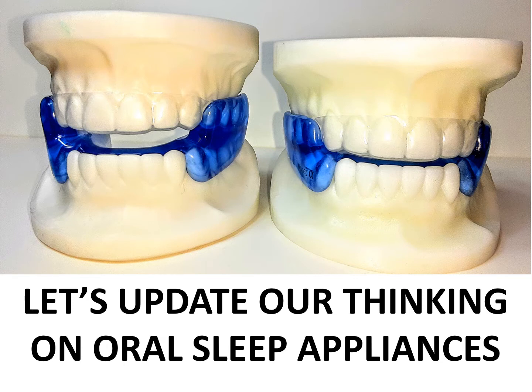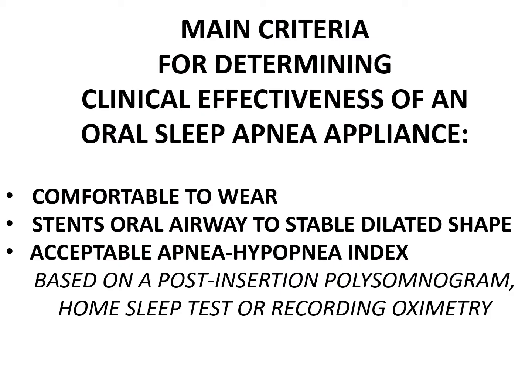There it is. So let's start updating our thinking on oral sleep appliances. The main criteria for determining clinical effectiveness of an oral sleep appliance: it's got to be comfortable to wear, and it should stent the oral airway to a stable, dilated shape, and it should create an acceptable apnea-hypopnea index based on a post-insertion polysomnogram sleep test, home sleep test, or recording pulse oximetry.